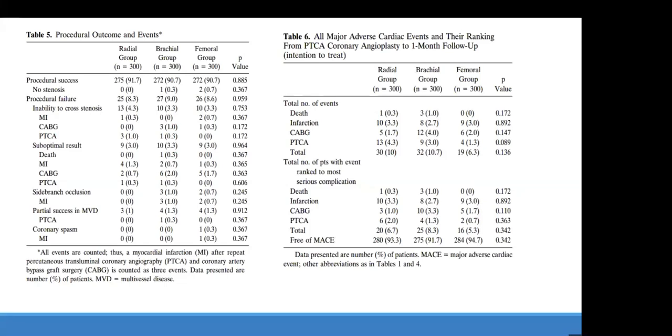It will not make it difficult. It will not increase its failure, even in complex procedures like CTO, that I do by radial sometimes. It doesn't make the success rate less. Yes, sometimes it's annoying when the guiding catheter is not sitting in the place. It requires a lot of patience, but it does not change the success rate of the procedure.